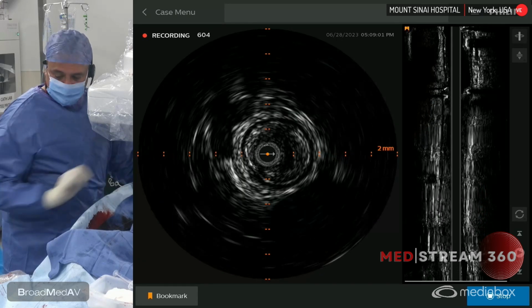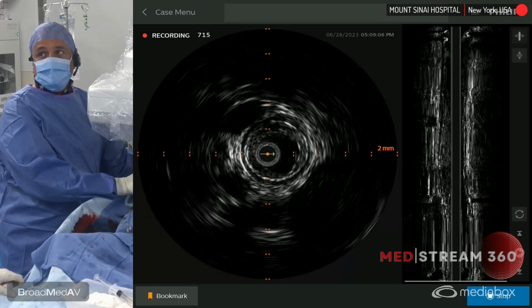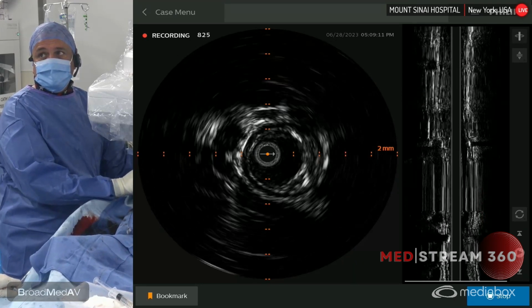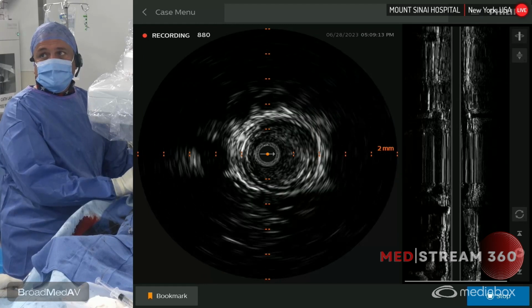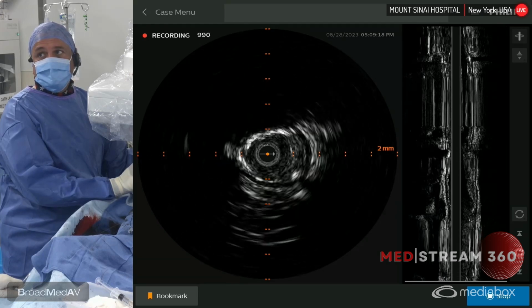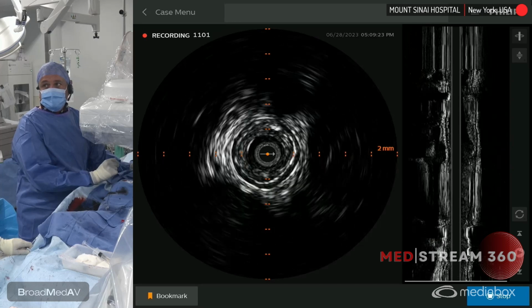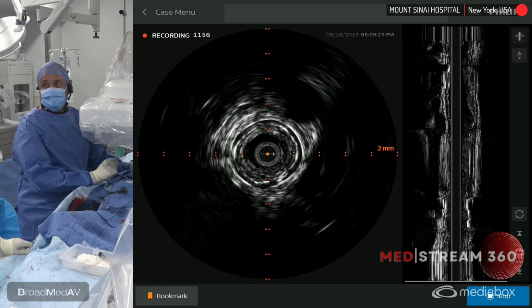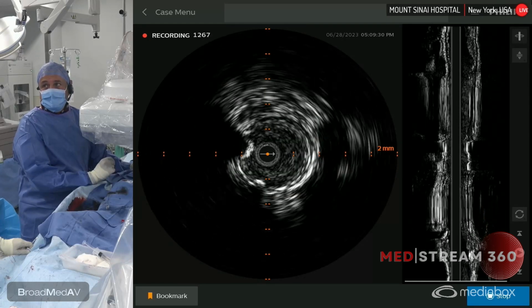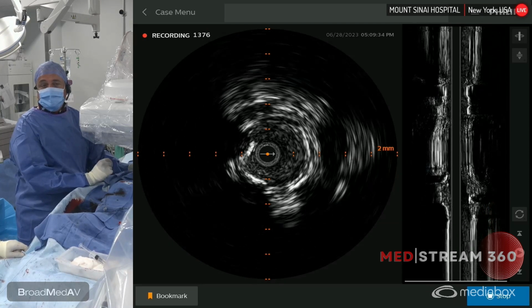And then you can see the different areas of stenosis. And as I pull back, you'll see again a calcified lesion, very tight, and then really pretty clean up until you get to the prox. There's some floating debris, likely thrombus at this area, and very tight in that area, likely thrombus again. Very speckled in appearance. This is fibrocalcific plaque. Okay, and then you have fibrocalcific plaque mixed with thrombus. There's again that speckle, and see how it's moving with the vessel? So that's layered thrombus for sure.